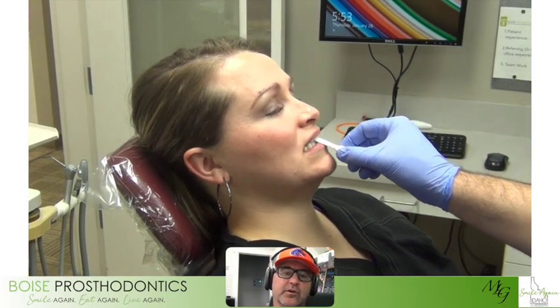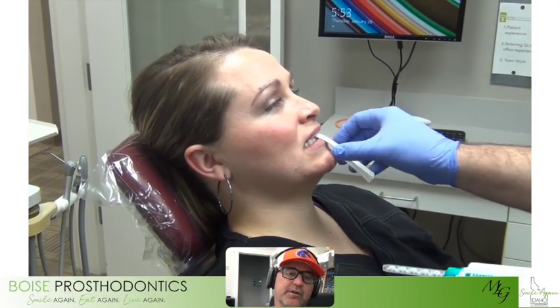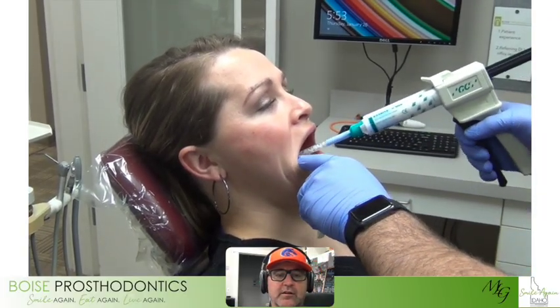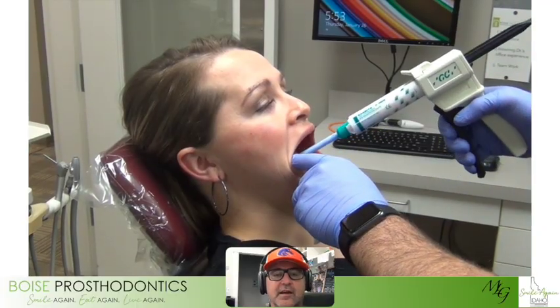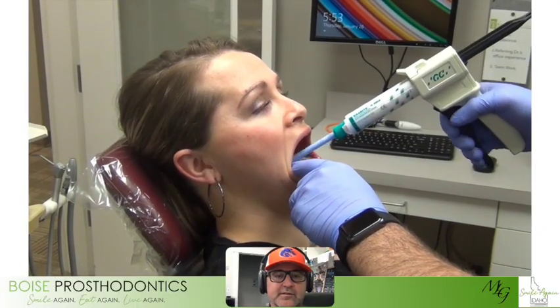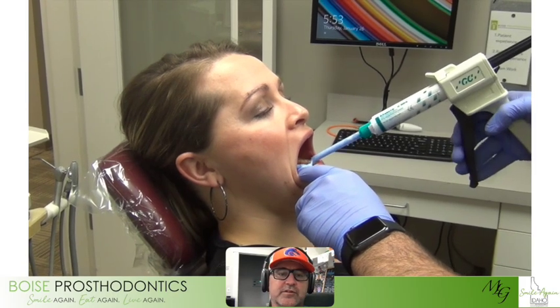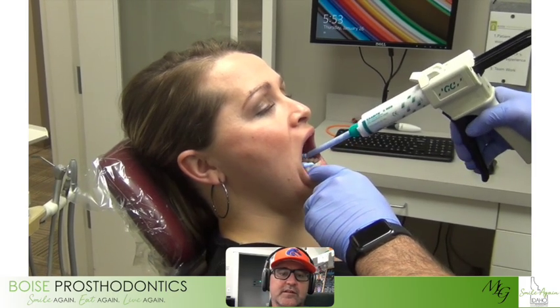Here's just a quick video of an employee showing how we gather that data. So once we identify that vertical dimension and that tooth relationship irrespective of the teeth using mainly the jaw, then we'll put that material on, or a bite material on each side. In this case, we use Exabite from GC America. Put some on the posterior teeth, leave some space in the anterior.